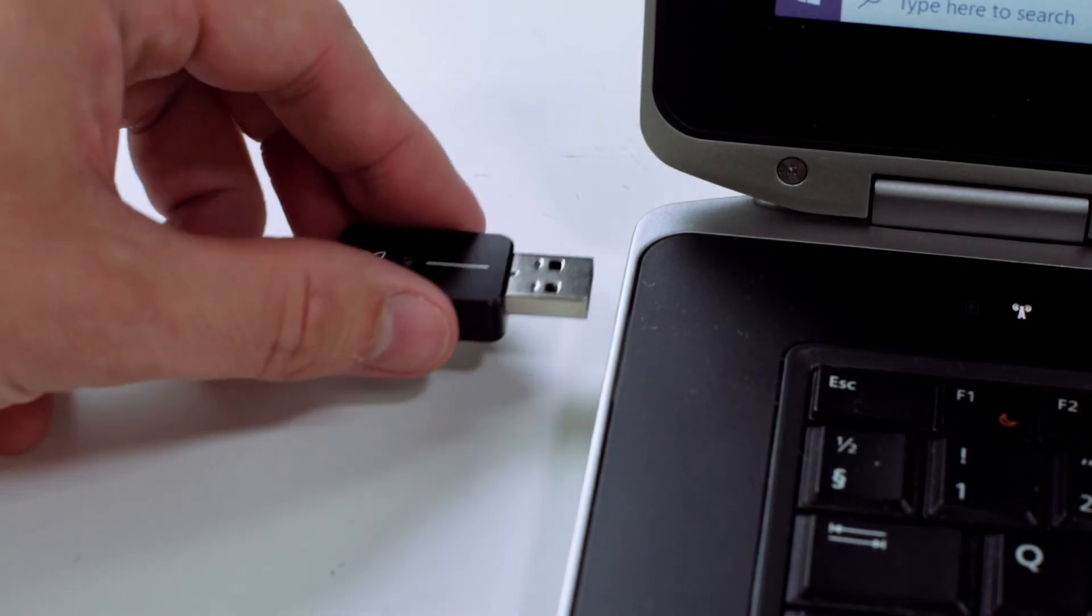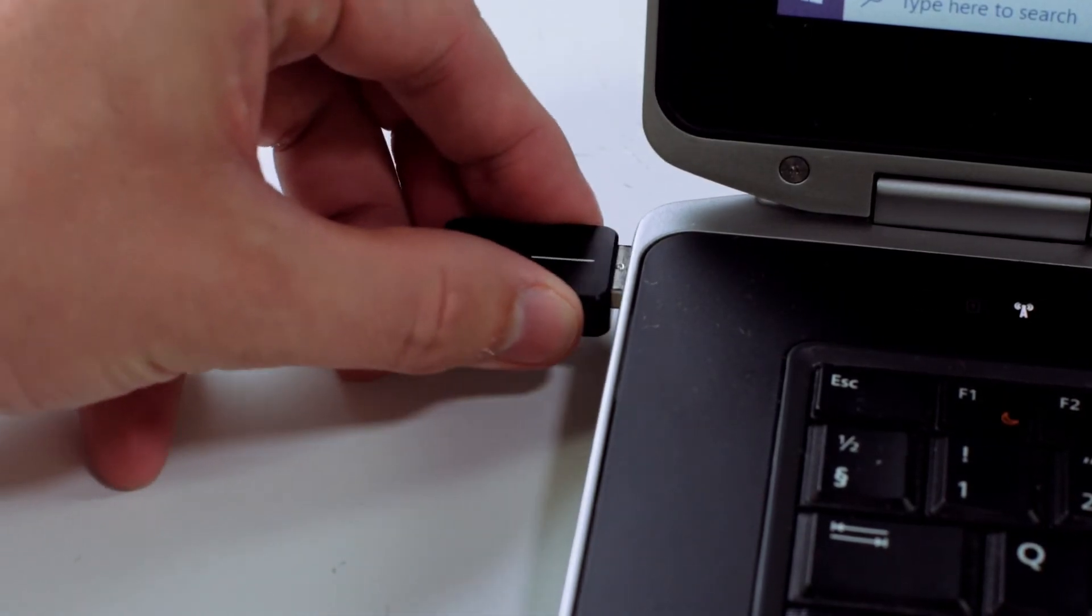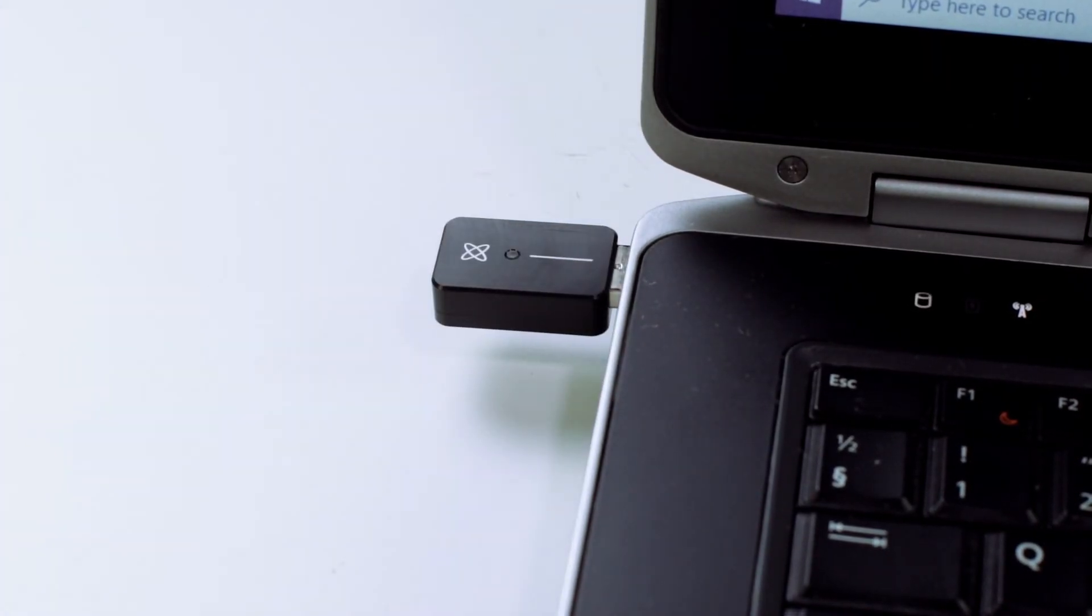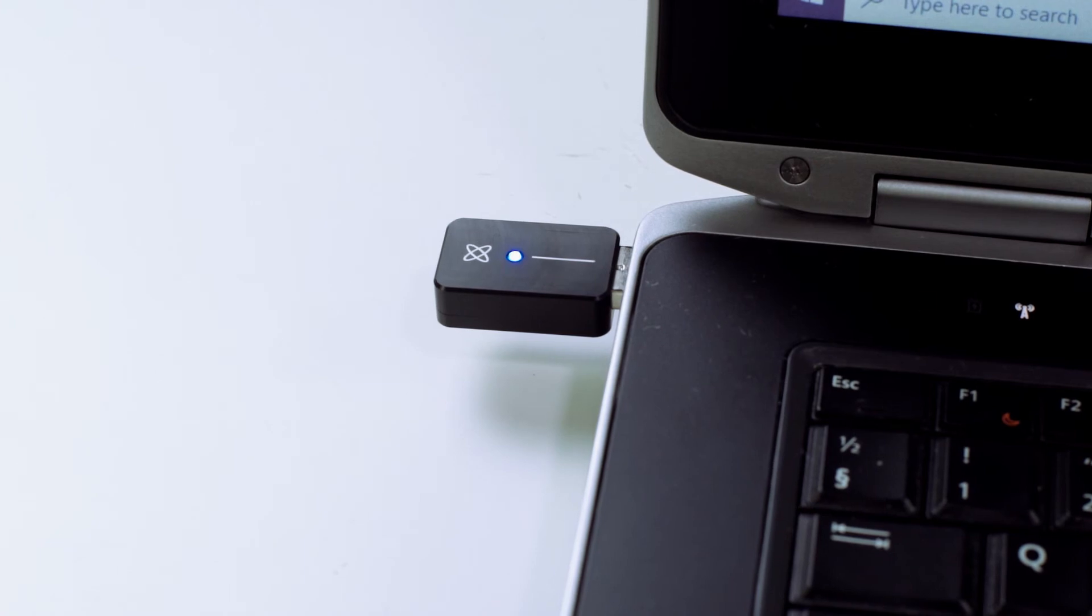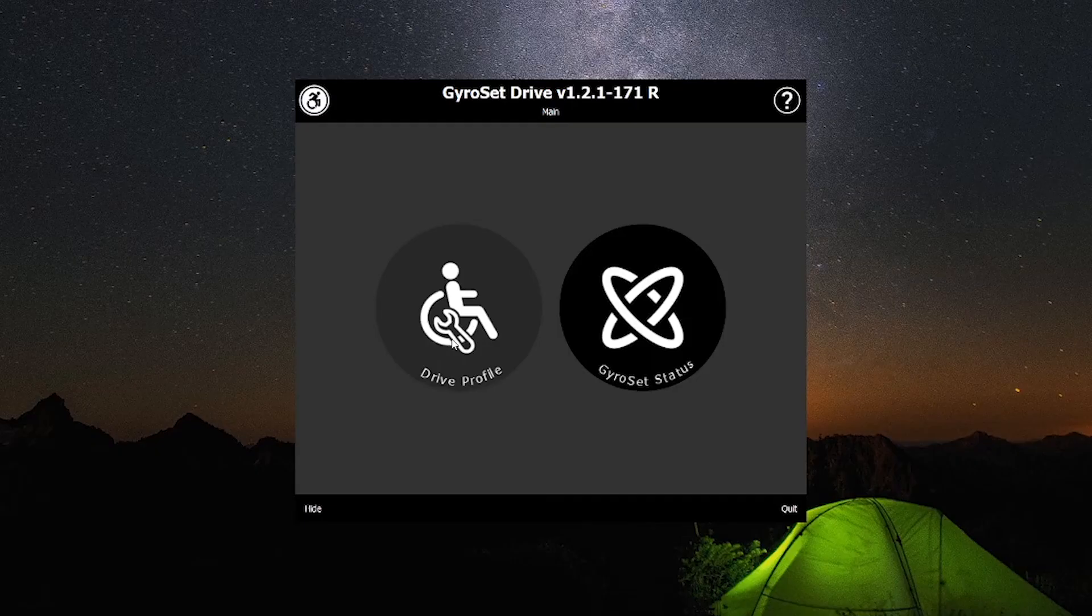Plug in the USB dongle to the computer. Wait until the light on the dongle turns continuous blue. Click on drive profile.